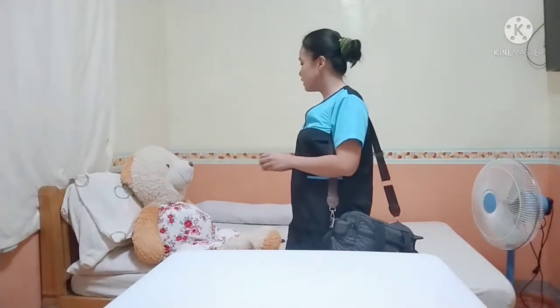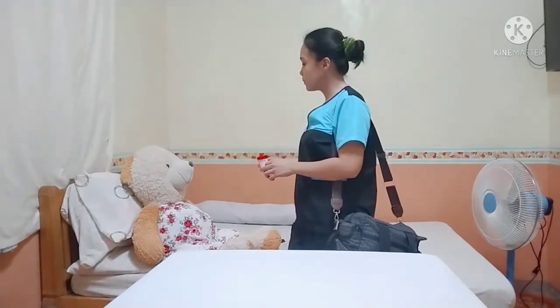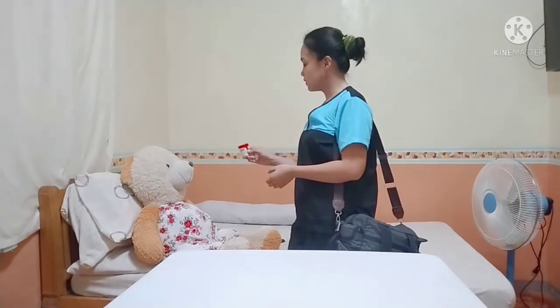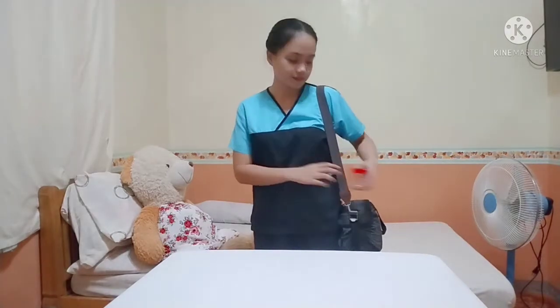So, ma'am, okay lang po ba na umihi po kayo kasi kailangan ko po ng ihi niyo po para po sa test later. Dito niyo lang po ilalagay yung ihi niyo po. So, okay lang po ba sa inyo yun? Okay po. So, assuming that the client already urinated.